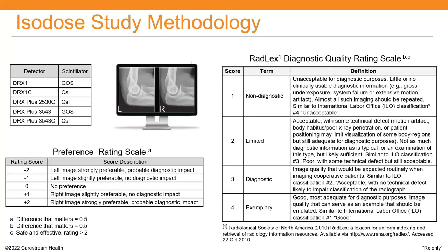After the ratings were completed, ratings were decoded such that positive values indicate favor for smart noise cancellation. For example, if the pair being rated has the SNC image on the left and the EVP Plus image on the right, and the rating is a -2, indicating that the preference is for the left image. Upon decoding, this case will have a preference rating of +2.